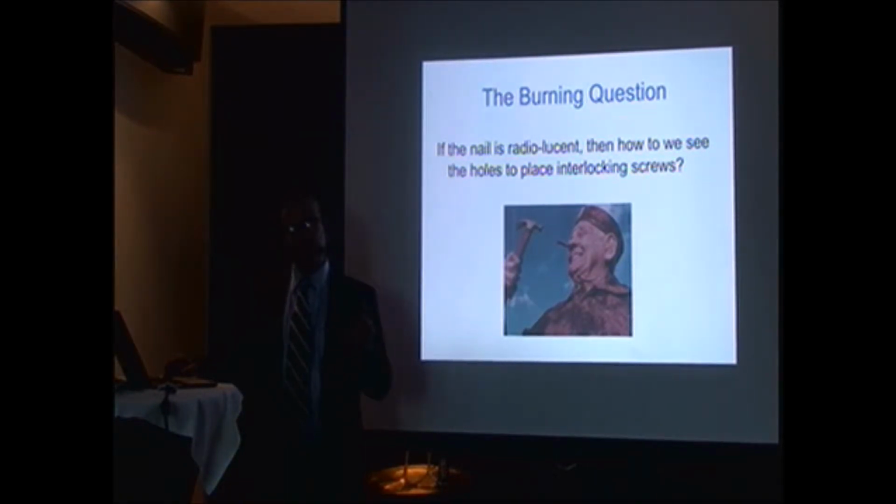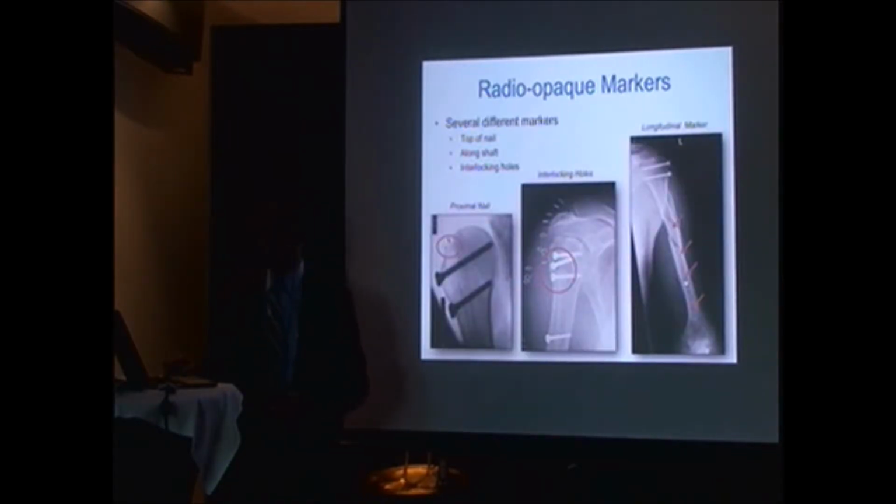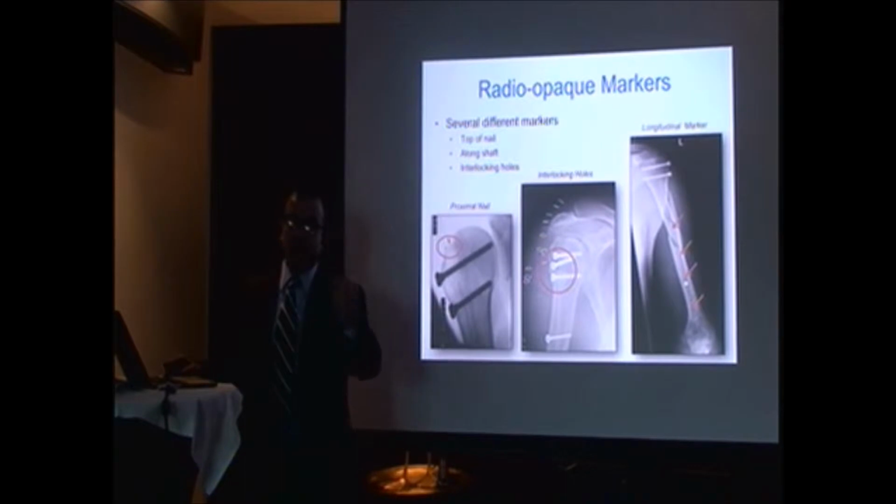So the first question I had was, well, if you can't see the implant, how do I know when I'm putting in a rod, or if I'm doing percutaneous fixation, where the hole is? Because when you have metal, I can look at the x-ray, I can see the hole, I can put my drill in the hole, and I know the screw is in the hole. How do I know where the hole is for the interlocking? So they devised a method where they put markers on the nail longitudinally so you can see the top and the length of the nail, and the real issue now is how to do the interlocking holes. I don't know if it's true in other countries, but the biggest problem we have in the United States with the community surgeon, the non-expert traumatologist, is it can take an expert 20 seconds to put a screw in.